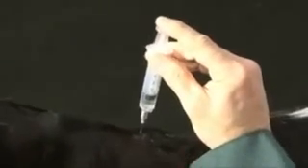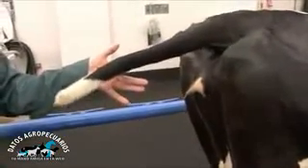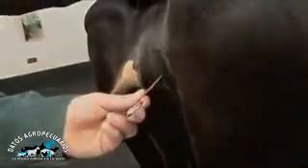When you are finished with the injection, remove the needle and syringe and allow approximately three minutes for the anesthesia to take effect. You can check the efficacy of your block by evaluating the tail tone of the patient. The tail should be flaccid and easily lifted. Pinching the skin around the vulva should also elicit no reaction from the patient following a successful epidural injection.